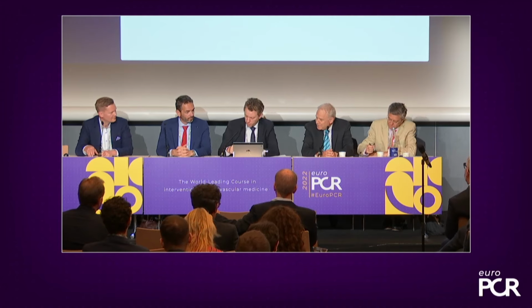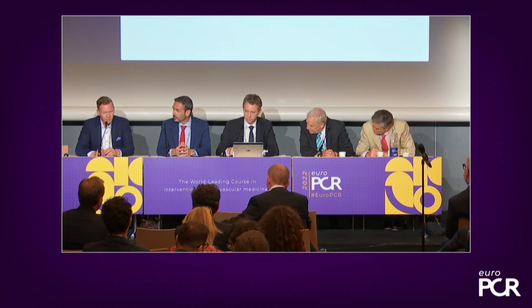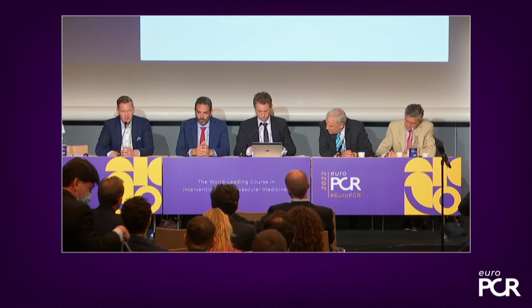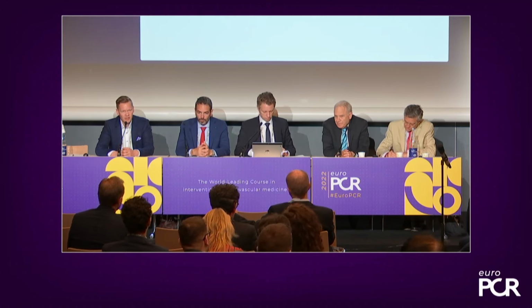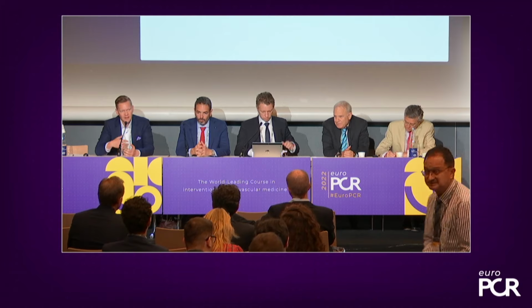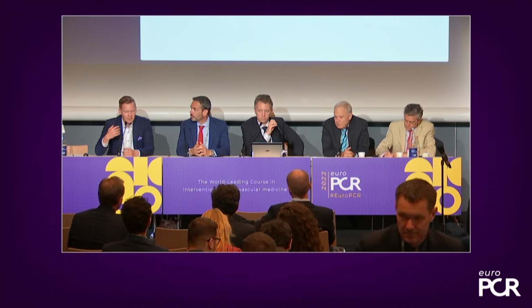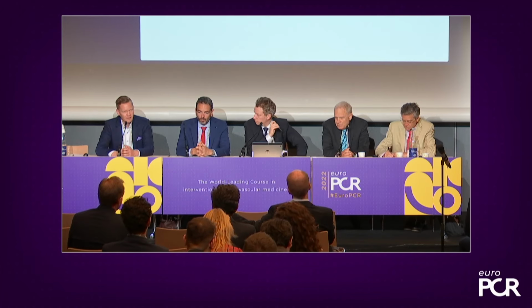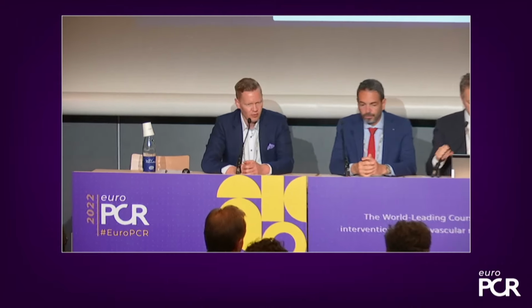Maybe a time for a quick comment from Tuomas. Yeah, I think we have to remember that we treat the patient and not the vessel, so that especially high bleeding risk patients are increasing up to 40% of the whole PCI population, and 10% of them are getting a bleeding. So at least with DCB-only technology, you can cease the DAPT therapy during the first four weeks. It's very, very important in this population. But we need an RCT, as Ron mentioned.